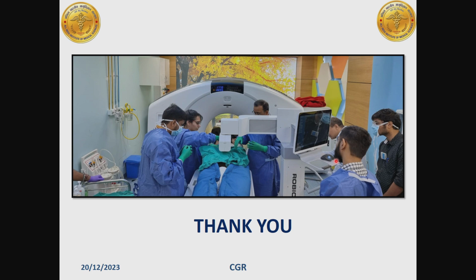As far as neurology is concerned, I think we can provide the coordinates to enter and reach the lesion, because stereotactic planning can be done. That much we can give, and then further the surgeons can use that and guide it. Thank you.